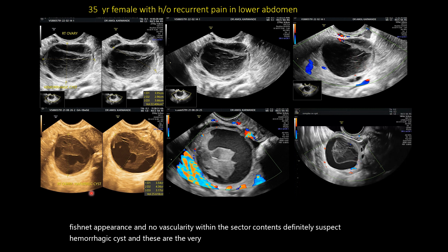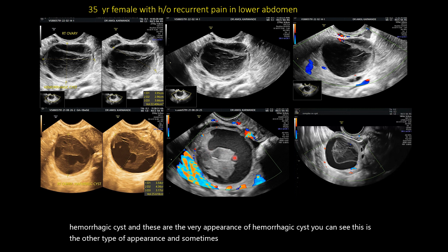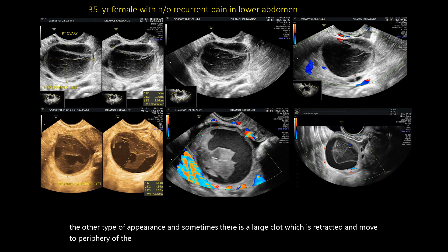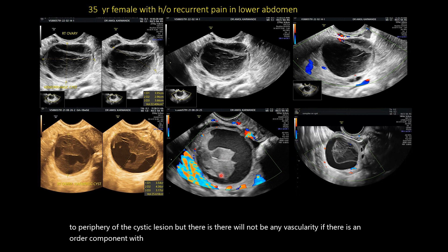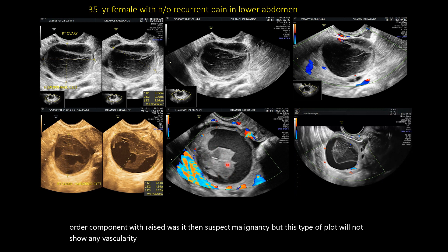These are the varied appearances of hemorrhagic cysts. Sometimes there will be a large clot which is retracted and moved to the periphery of the cystic lesion, but there will not be any vascularity. If there is a nodular component with raised vascularity, then suspect malignancy. This type of clot will not show any vascularity on color Doppler.